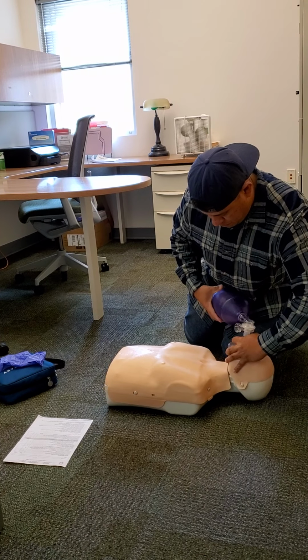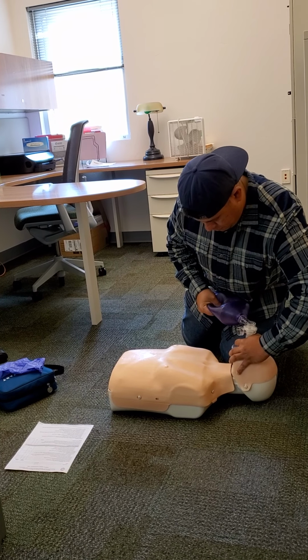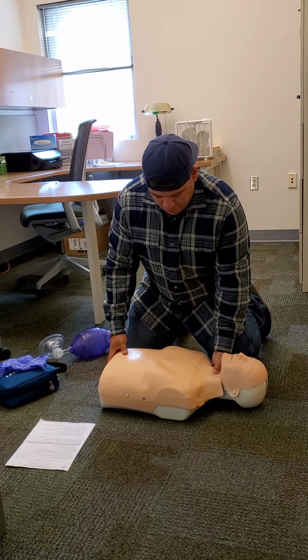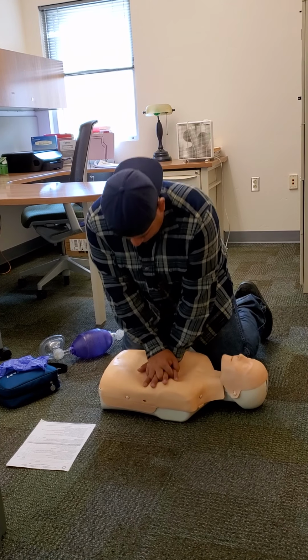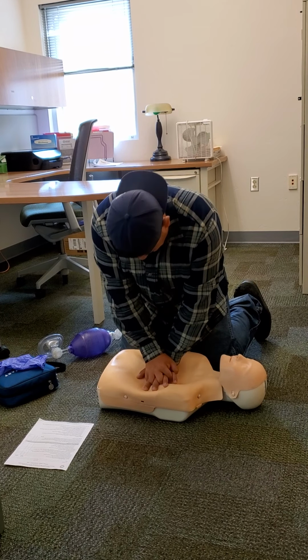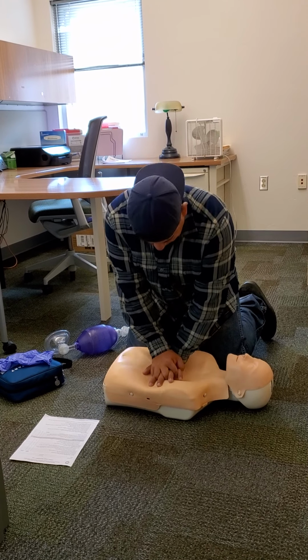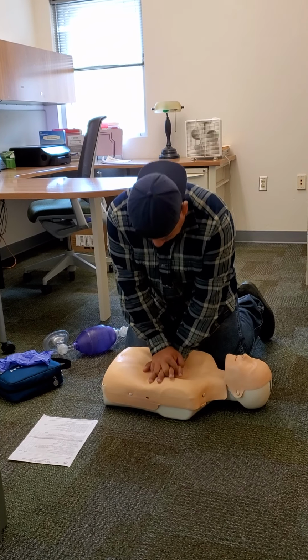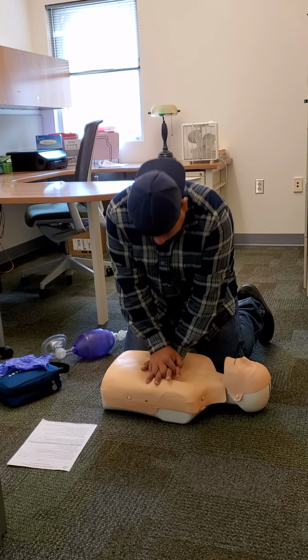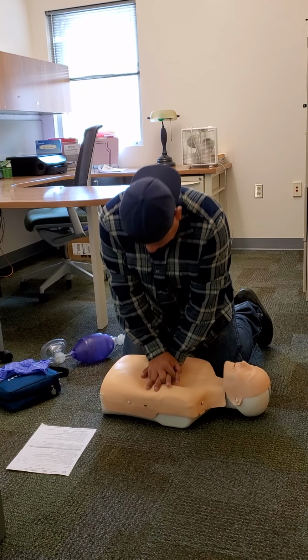When he's on about his 5th cycle of compressions to ventilations, we're going to let him know that either a partner or a bystander shows up with an AED. He would verbalize to us that he would have somebody take over compressions and ventilations. So either a partner, somebody else who's trained to do CPR, while he gets the AED ready for the patient.